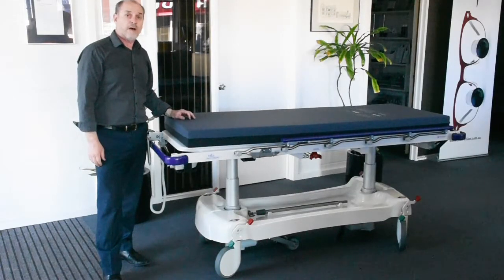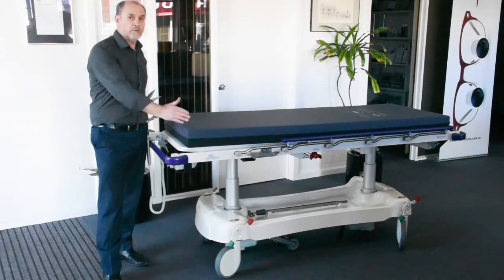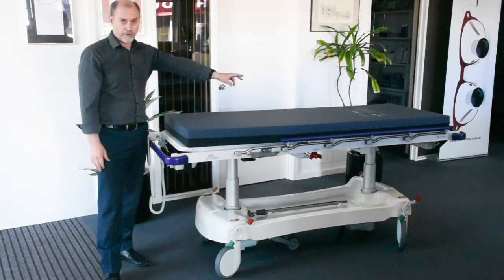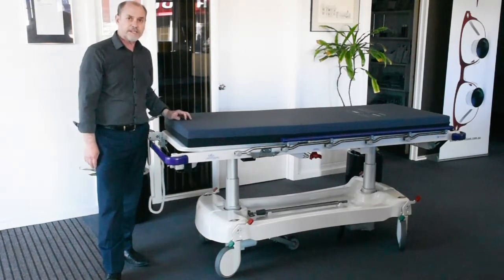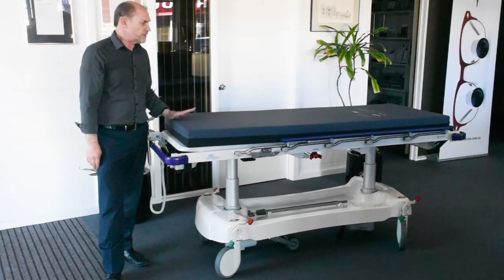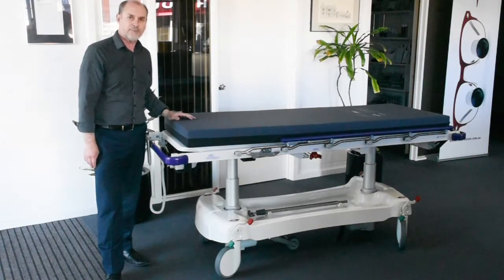This barouche is also available in a variety of length and width options — you can get it narrower, wider, and shorter — and the appropriate mattress is provided. There's a range of optional accessories as well, with a long list of those. If you have any questions, contact me and I'll help you out. Thank you and goodbye.